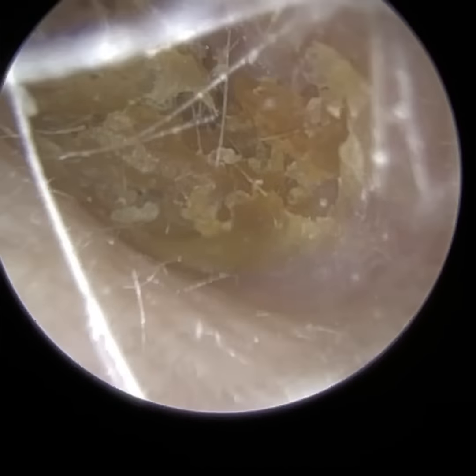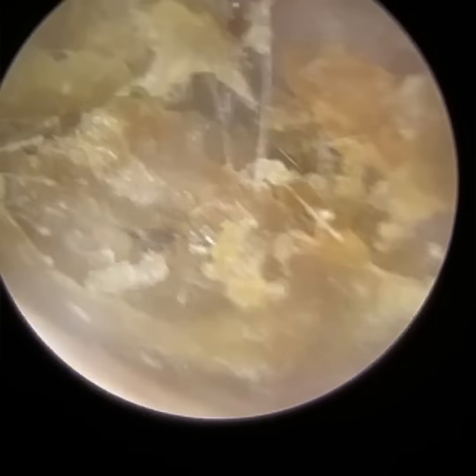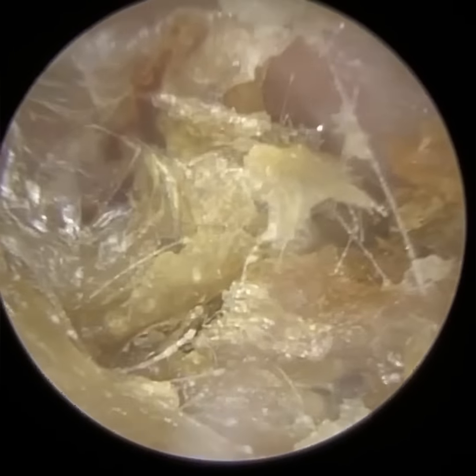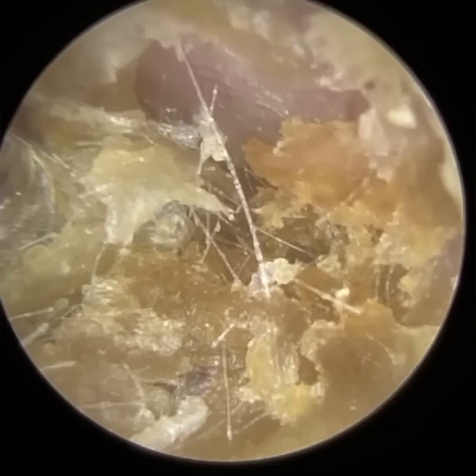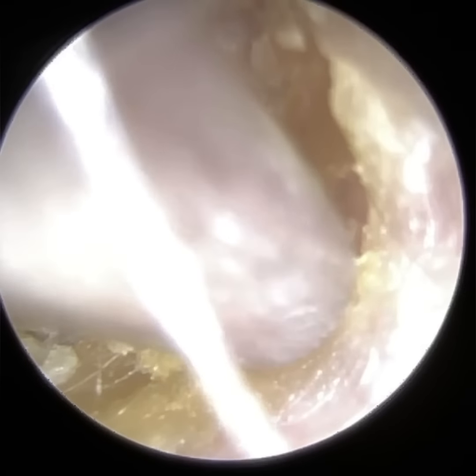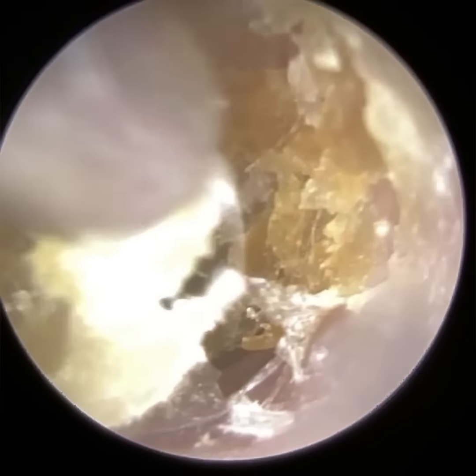I have a really interesting case here. A patient who attended with bilateral, fully occluding, really dry, crusted, dead skin. So there's no earwax here. This is all dead skin that was formerly lining the ear canal itself. And this skin has since died and become desquamous, so it's shed, but it hasn't come out of the ear. Instead, it's formed into a plug and it's occluded the ear canal.